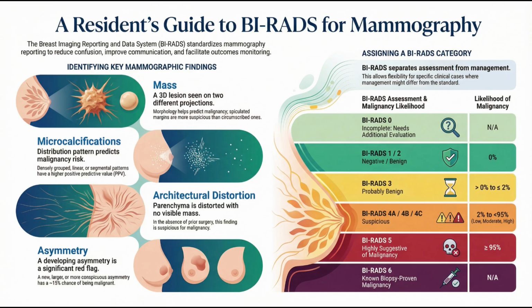And that layering is the definitive proof that it's benign. That's a classic radiology aha moment. So finally, the term punctate is for the really tiny ones. Yes. Round calcifications are benign when they're diffuse and small, under a millimeter. But if they're really microscopic, smaller than half a millimeter, the correct term is punctate.